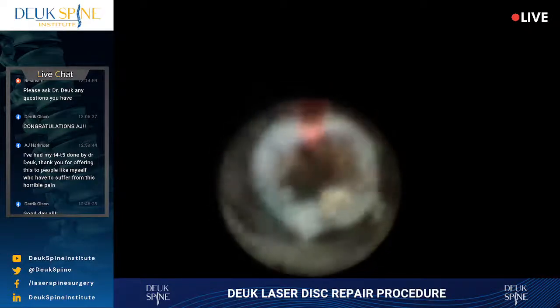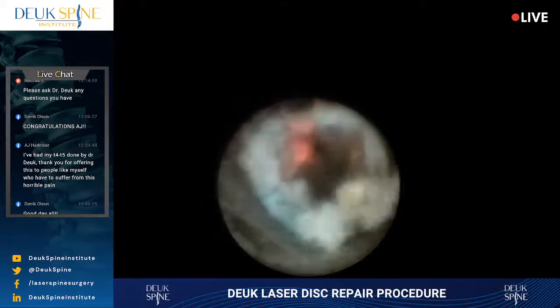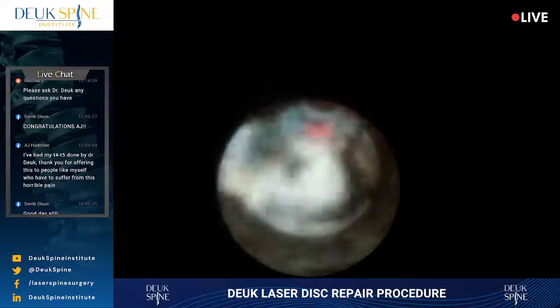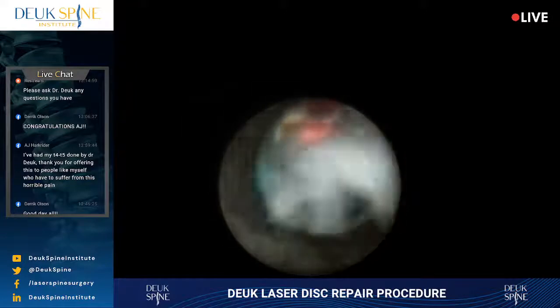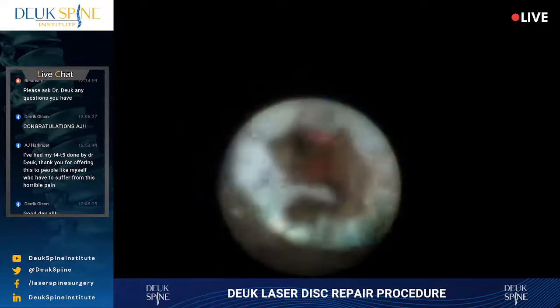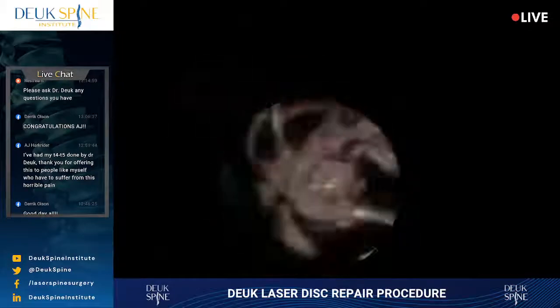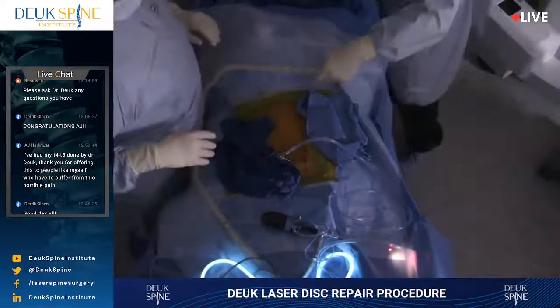Okay, just about done here. One minute. There's fat in the foramen, so we are out of the disc. That is the foramen. We're done. Beautiful. Scope off.